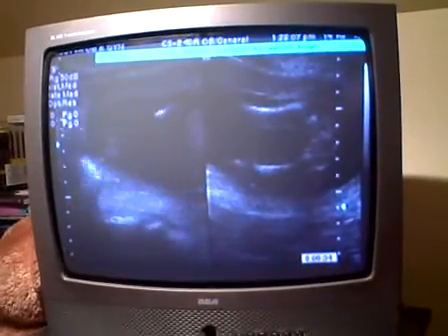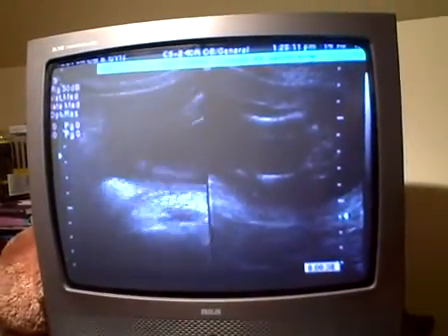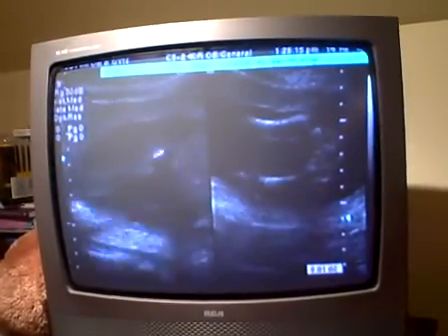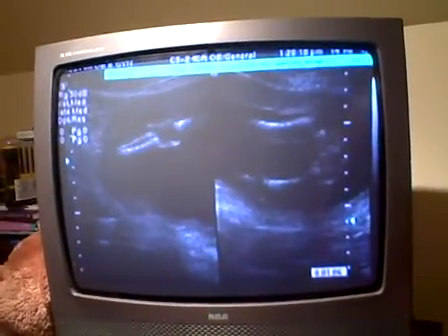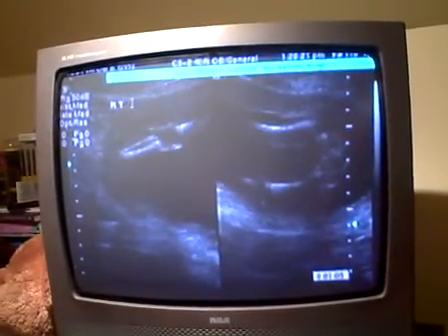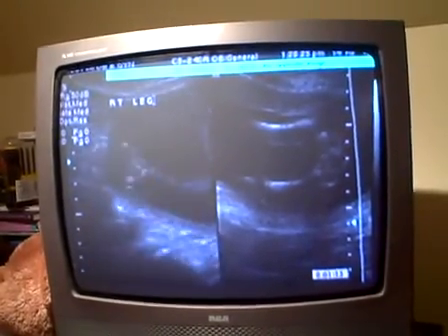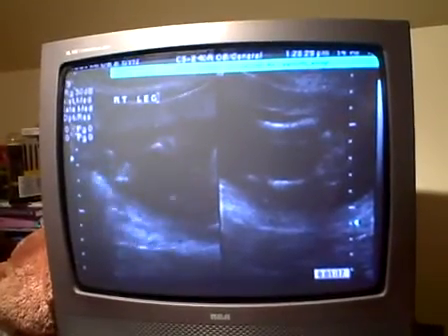I'm guessing those are legs, but I'm not sure. The heart rate, by the way, was 158, which is normal. Oh, that's a leg — it was just stretched out. So those are the two bones in the lower leg and the upper bone. You can see kind of the chicken leg movement thing going on there. That was the right leg.